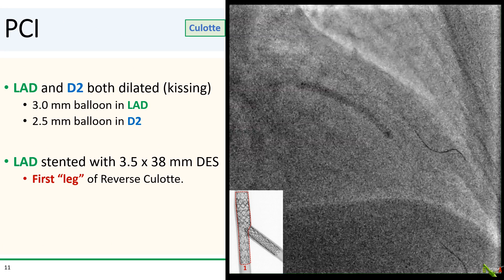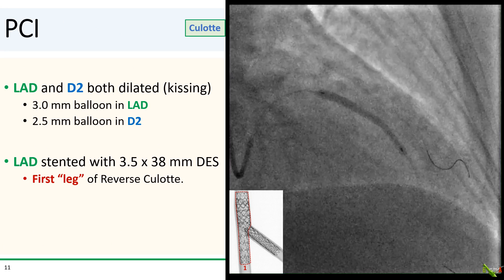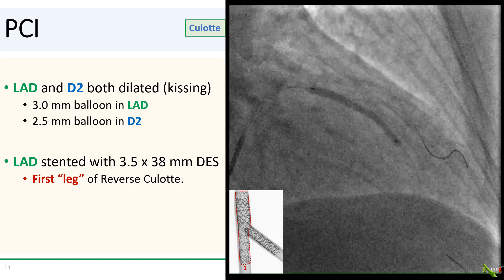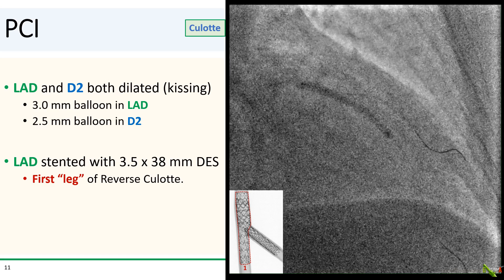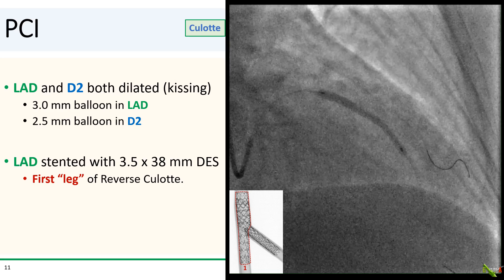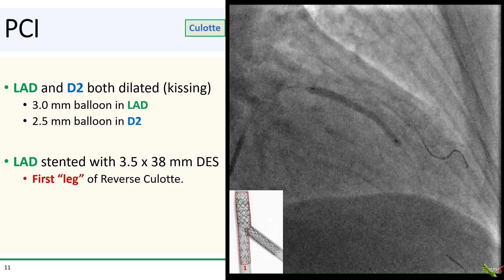All right, so here we go. The LAD and D2 were both dilated with kissing balloon angioplasty. We then stented the LAD with a 3.5 by 38 mm DES, and this forms the first leg of the culotte. Again, I'm doing reverse culotte here even though I was planning from the beginning on a two-stent strategy.